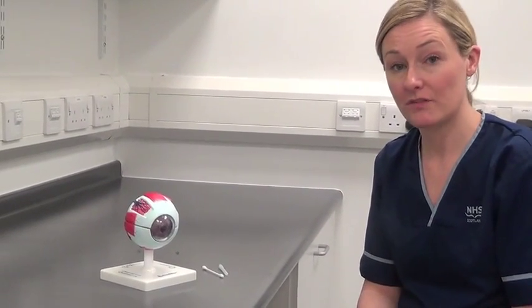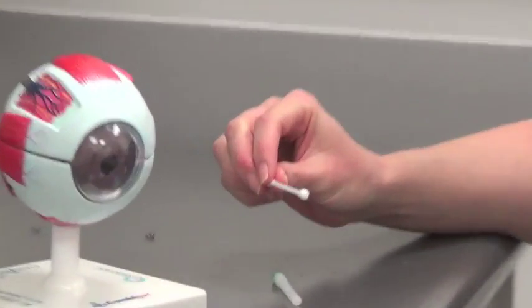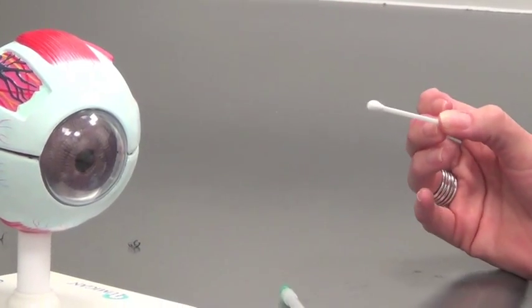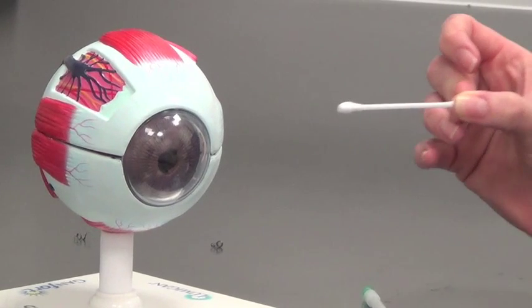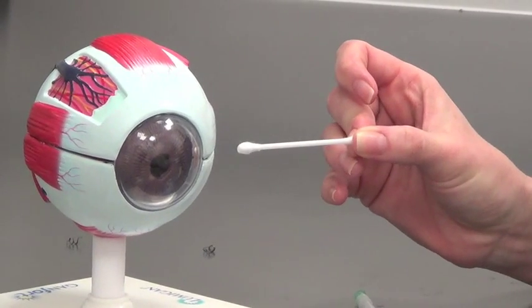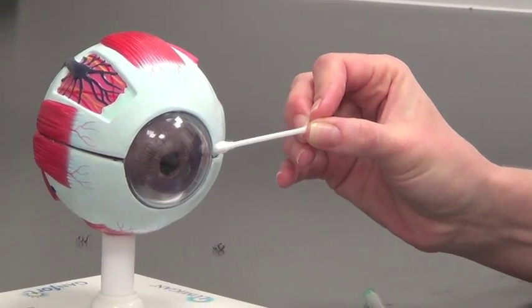Removing a foreign body from the cornea using a cotton bud: bring the bud in from the temporal direction in a horizontal direction. Bring it over to the foreign body and take it off with the bud in a swiping motion.